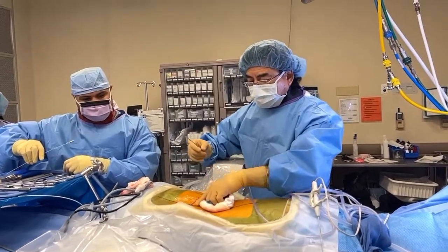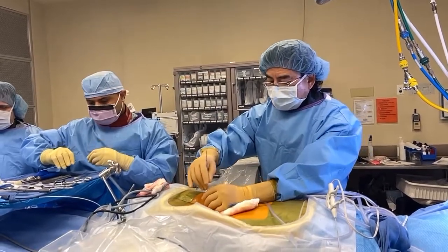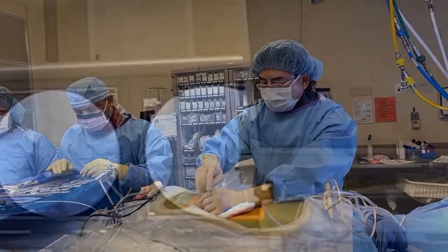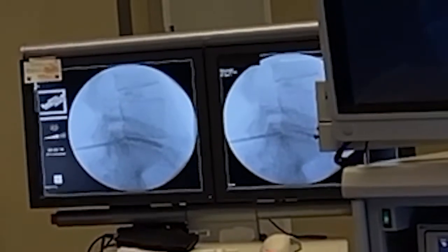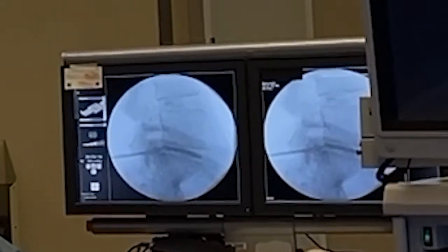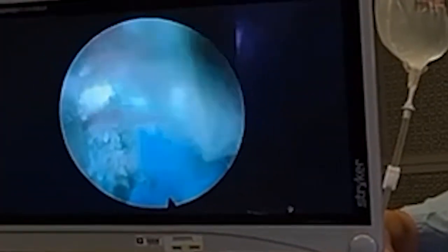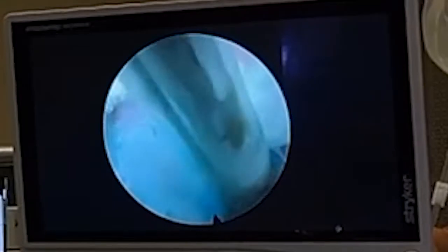Okay, same thing. Perfect incision. Spaghetti noodle dilator. Delicate Asian fingers. And the force, Luke, the force. Oh yes. Jeez, that was not easy. Shot and save. Okay, so I'm looking outside, or out toward me laterally. At 6 o'clock, or behind, under 6 o'clock, is the nerves.